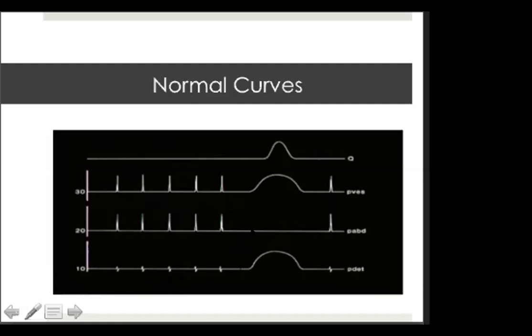So during voiding, this is the time of the voiding line. So opening of the sphincter, sir. This should be with the detrusor and the vesical. Then the urine flow starts. So this is the urine flow.